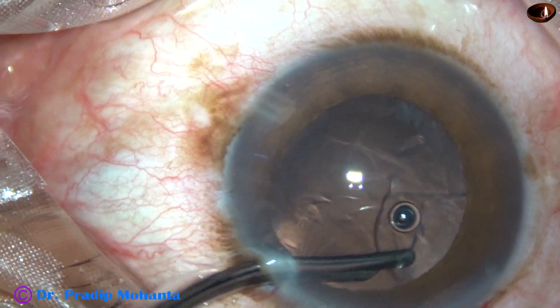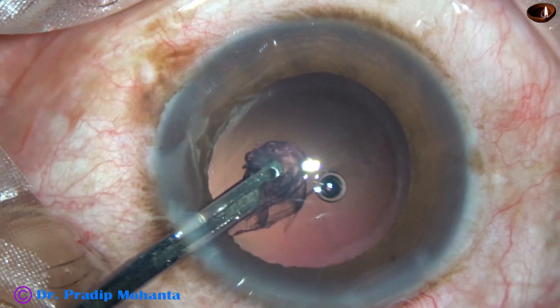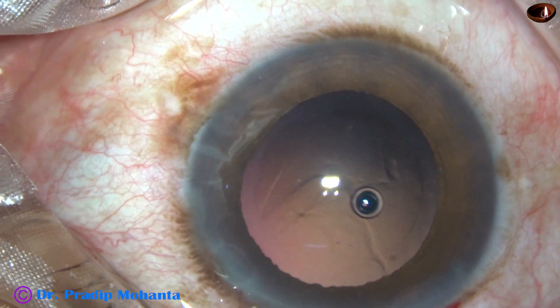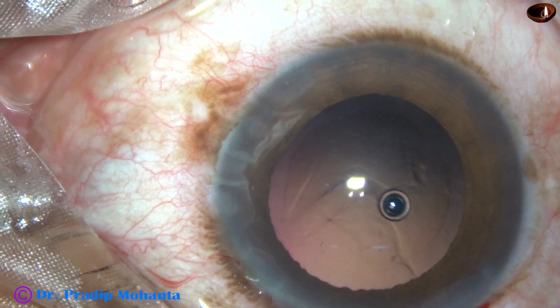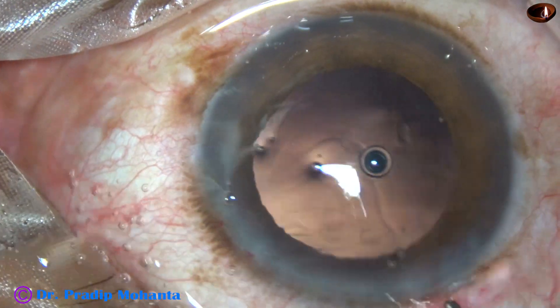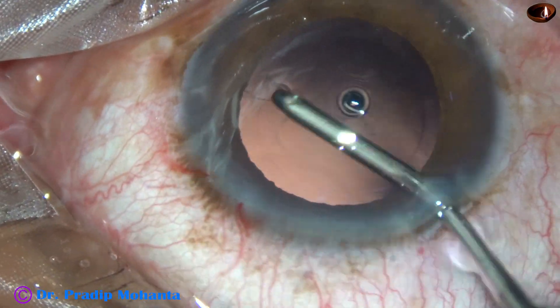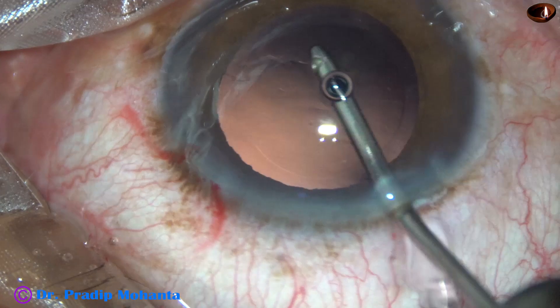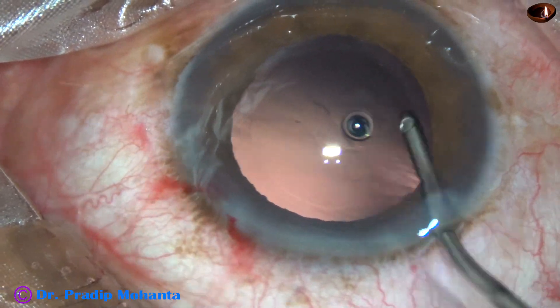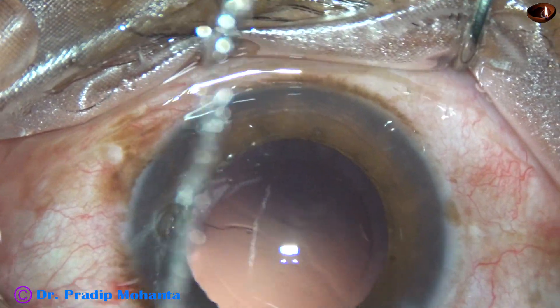Now I go through the left side port and start removing the rest of the cortex, and it comes out in no time. This is a very nice cleaning of the cortex. A little bit of polishing of the posterior capsule is being done just by the irrigating fluid — no aspirating cannula is used; just irrigation to dislodge the lens epithelial cells.